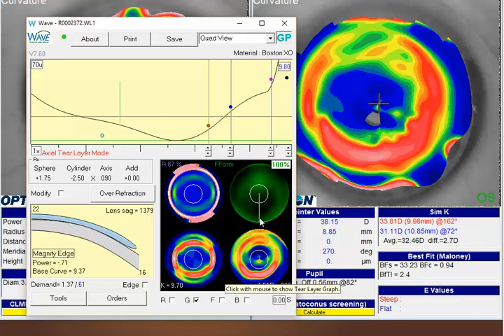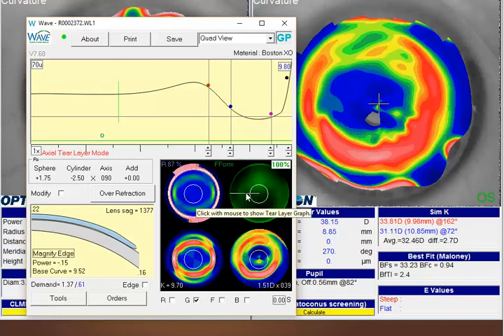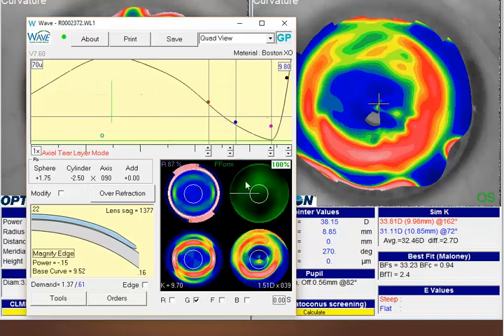And in this particular situation, since you have so much central corneal scarring, my guess is because you have this inconsistent area of clearance, you just aren't getting any real benefit out of the RGP to flatten out that scar or to even out the optical effect from that. That's probably also why when you put the left lens, which is basically a little flatter centrally, onto that right cornea, you probably got a little more compression across its surface, smoothing out the irregular contour.